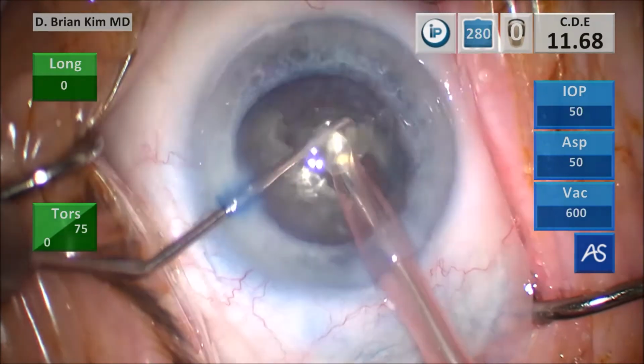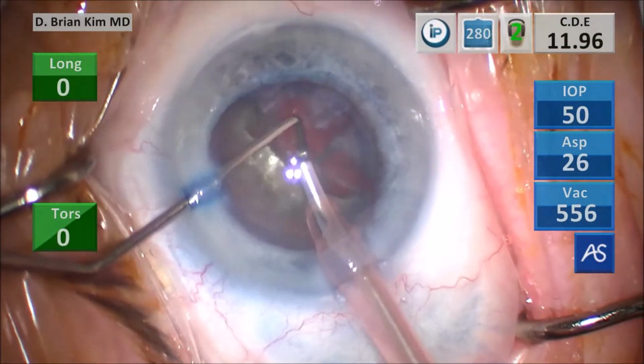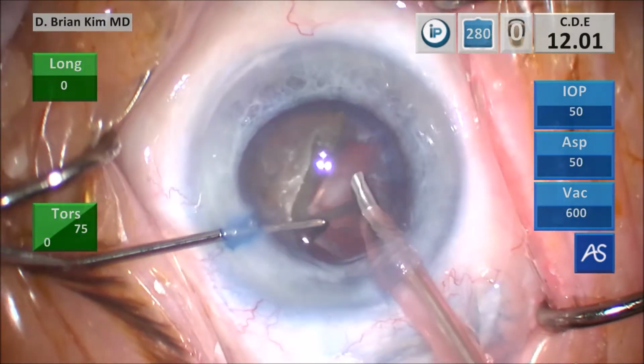Once it's loose and broken up, grab it with some vacuum, crushing the lens between the instruments and emulsifying the lens piece. So again, using crushing force to utilize less ultrasonic energy.